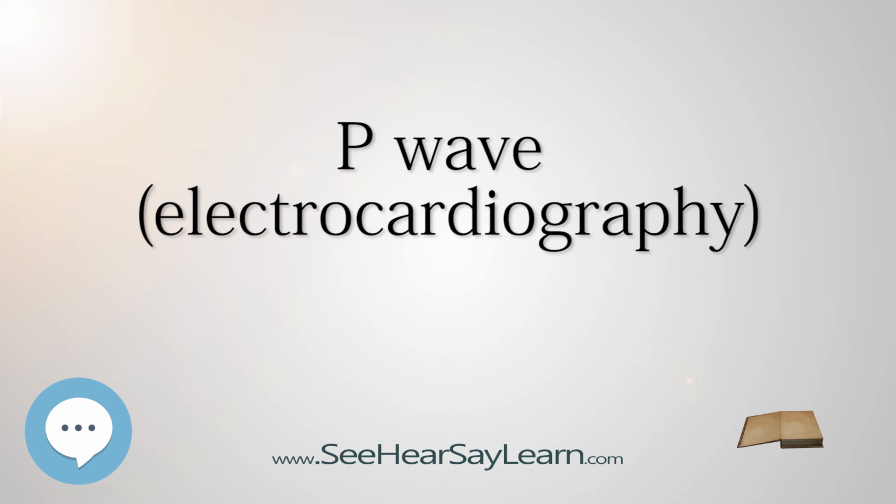Atrial repolarization. This occurs a mean of 320 milliseconds after the end of the P wave, with a duration of 2 to 3 times that of the P wave and a polarity always opposite to that of the P wave. It is represented on the surface ECG by a so-called TA wave.